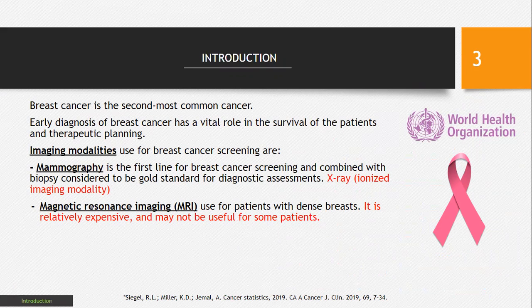Mammography, when confirmed with biopsy, is the first gold standard used to diagnose breast cancer. Patients with a higher density of breast tissue or other restrictions are often reliant on the MRI screenings. However, this process is relatively expensive and not always applicable to most patients.